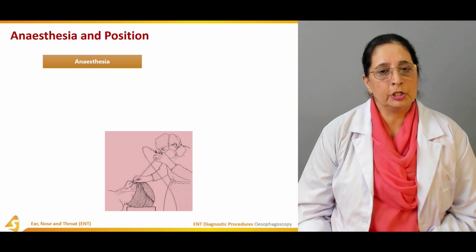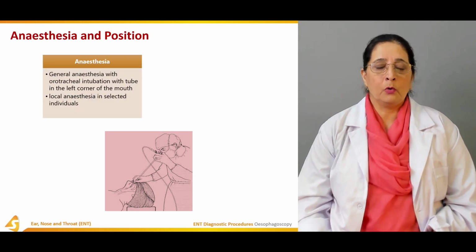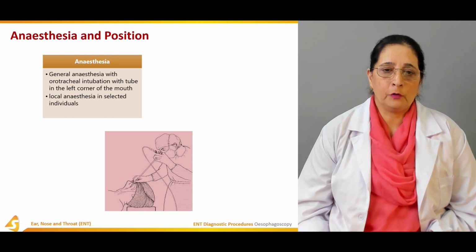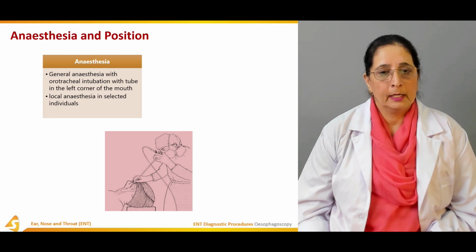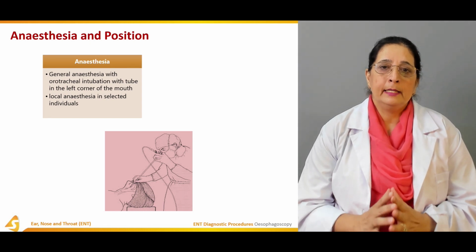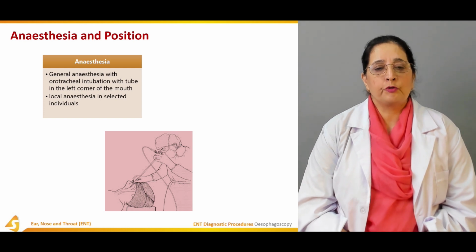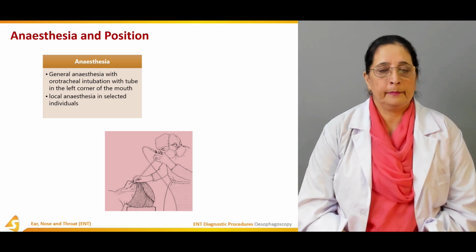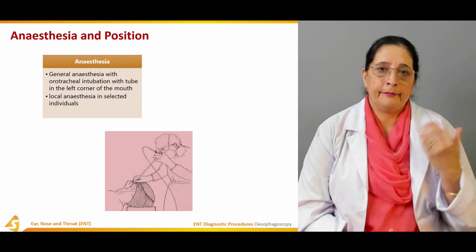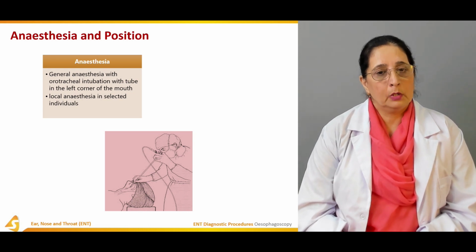Anesthesia and position. Anesthesia is general anesthesia with orotracheal intubation, with the tube in the left corner of the mouth. Local anesthesia in selected individuals.